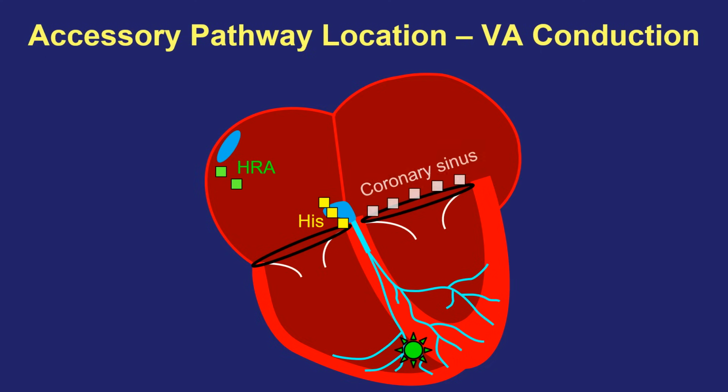And so how do we determine where is the earliest site of atrial activation? Well, that informs in part where we put catheters during a standard EP study looking for SVT. We put an atrial catheter in the high right atrium, which is over lateral, so we have information from the lateral portion of the right atrium. We put a catheter up in the coronary sinus and thread it in that AV groove along the coronary sinus between the left ventricle and the left atrium with the tip over here out lateral.